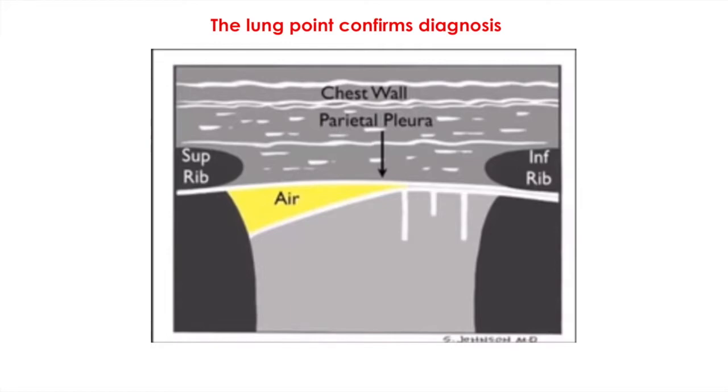I have chosen to talk to you today about 3 main frequent neonatal lung pathology, and I will then list other possible scenarios of pathology where lung ultrasound is now playing an important role. First, pneumothorax. In a pneumothorax, the visceral and the parietal pleura are separated. Then, if they are separate, the lung sliding will disappear.